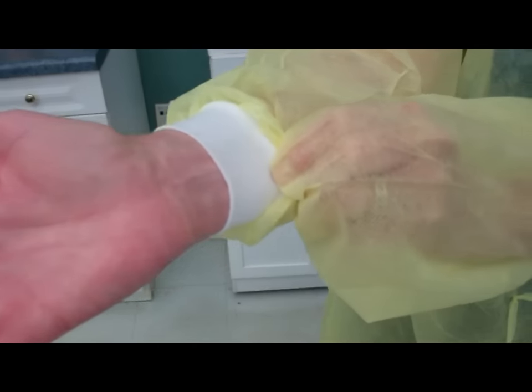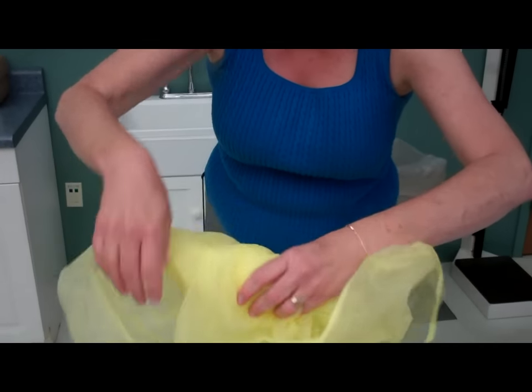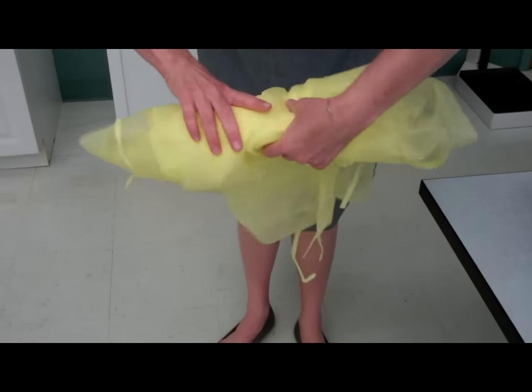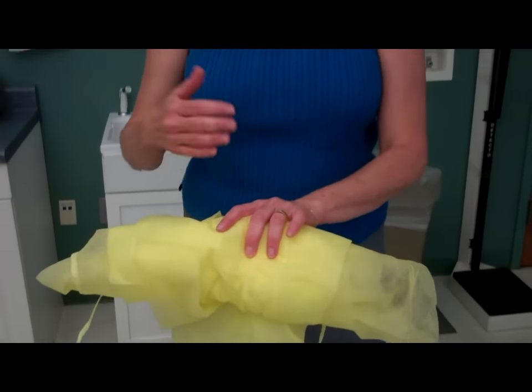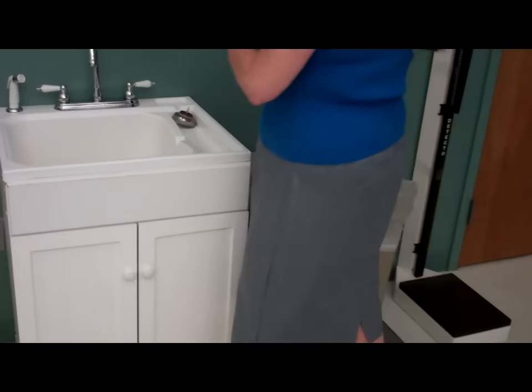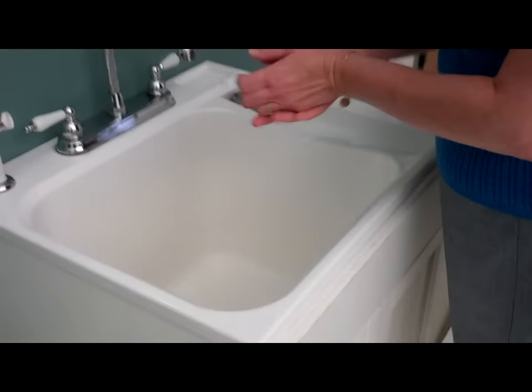I will now take my hand and pull this hand in, pulling the cuff over. Now, I will take the gown, holding it away from my body. I will turn it inside out so that now the clean side that was against my body is on the outside and the soiled area is on the inside. I will now dispose of that in the trash container. And I will state, for testing purposes only, I will now wash my hands. And that concludes PPE.